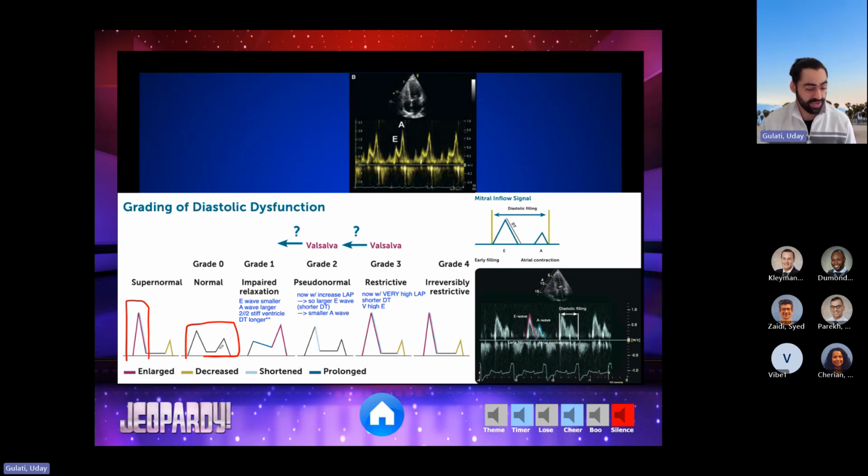However, if I start to develop diastolic dysfunction, for example from the heart constantly working against a strong afterload, like high systolic blood pressures, then I'm going to get less passive filling from E, and instead I'm going to rely more on the atrial contraction, which is the A. A for atrial contraction, and E is passive. So the A starts to increase. However, if I keep this up, for example with chronically uncontrolled high blood pressure, then eventually the left atrium starts to enlarge. We see that pretty often.